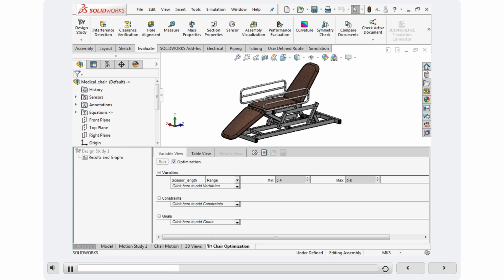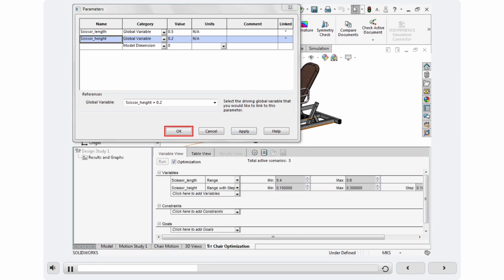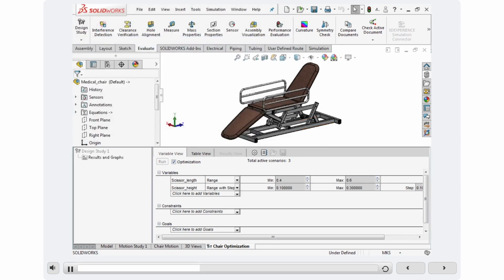Now, we will add a second variable. Under Variables, click the drop-down arrow to add a variable. Click Add Parameter to add a second parameter, with scissor height as the name, global variable as the category, and 0.2 as the value. Apply the changes and close the dialog. Under Variables, click the drop-down arrow corresponding to the variable scissor height and click Range. Enter the value 0.15 as the minimum of the range and retain 0.3 as the maximum of the range.